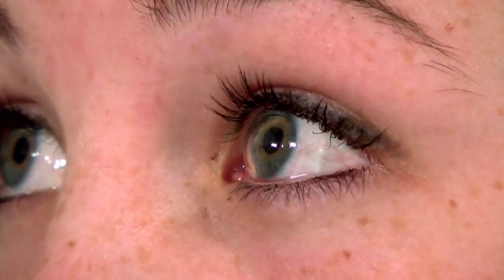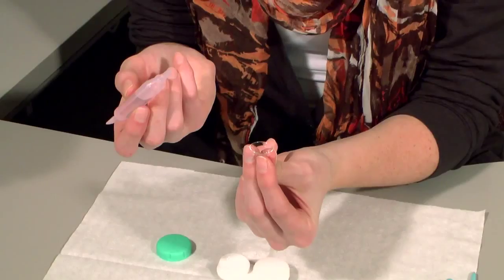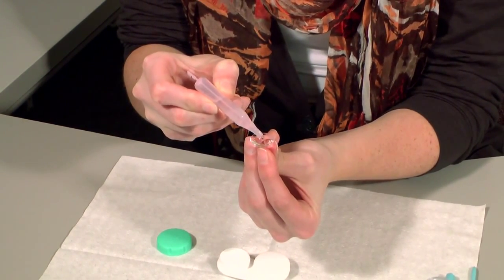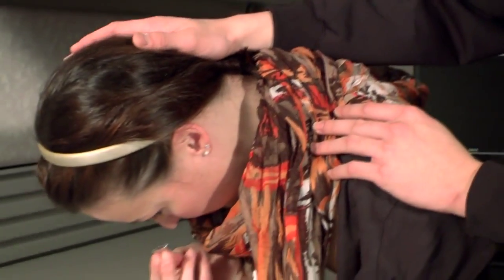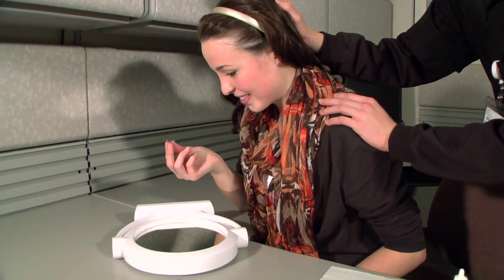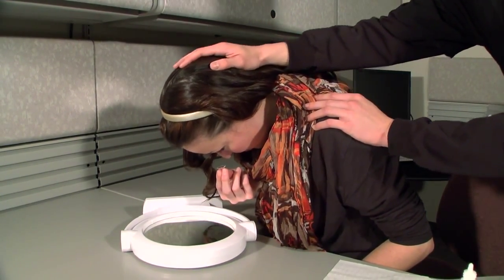Air bubbles will make the lens move on the eye, making it uncomfortable, and it may also be difficult to see out of the lens. If you can't avoid air bubbles, it's highly likely that you're unable to maintain fluid in the bowl when inserting or just haven't been filling the bowl with enough fluid. Make sure that your face is fully parallel to the floor as you bring the lens toward your eye. It may seem like you're nearly standing on your head when you're in the correct position to apply the lens.